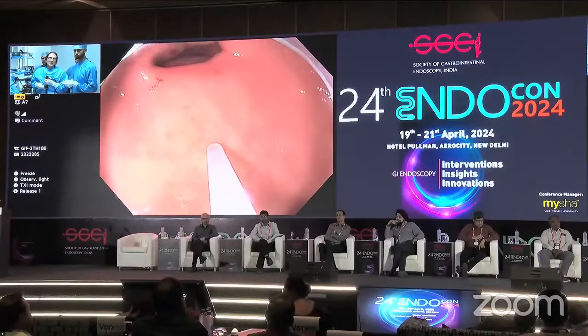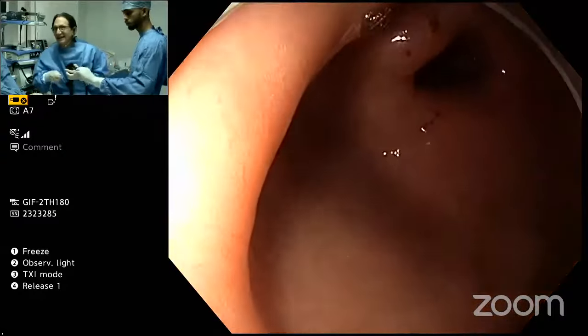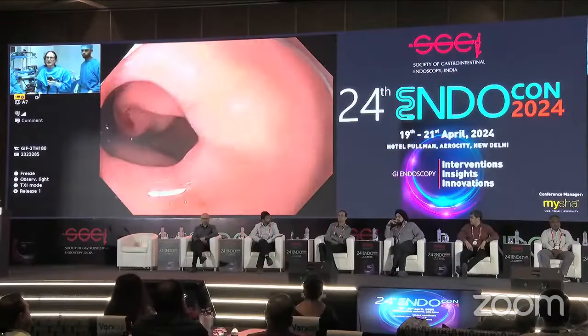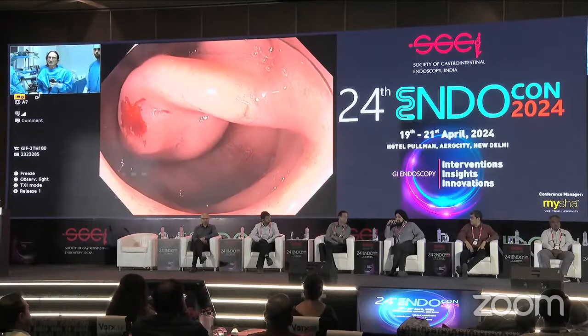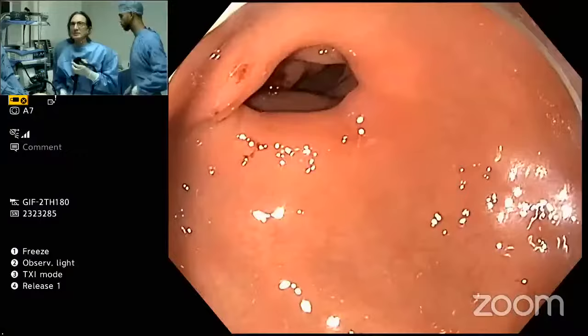Dr. Binmoeller, can you hear us? Yes, I can hear you. Is there any particular point in the polyp where you want to make this puncture, or it can be anywhere? Base or apex? I'm just going to loop it now.